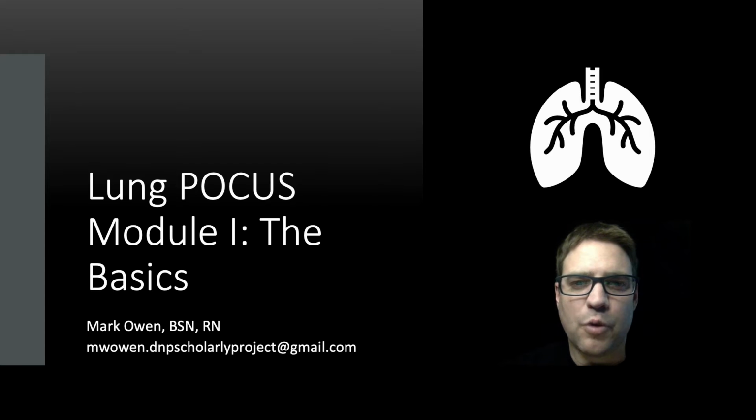This is the first of a 4-part series designed to help the advanced practice provider, the APP, such as nurse practitioners and physician assistants, as well as the APP student, to improve their knowledge and skills in the use of lung POCUS to diagnose pulmonary edema, pneumonia, and pneumothorax. The goal of this Doctor of Nursing scholarly project is not to make you an expert, but to awaken an interest in lung POCUS and to give you a basic sense of what it can do.